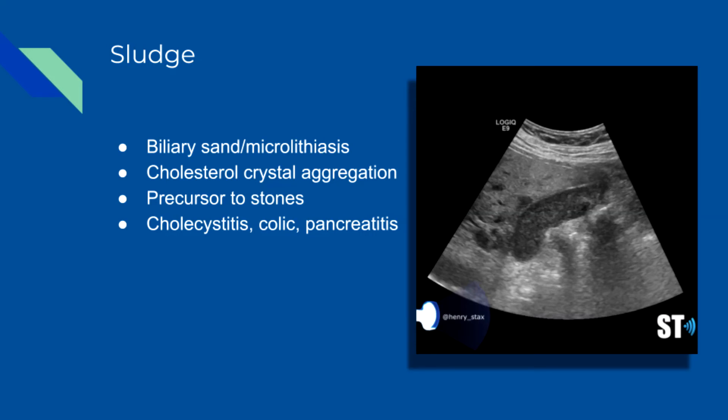Biliary sludge is a very common finding on gallbladder sonography. It is also called biliary sand or microlithiasis. It is mainly comprised of calcium bilirubinate crystals and lesser amounts of cholesterol crystals.